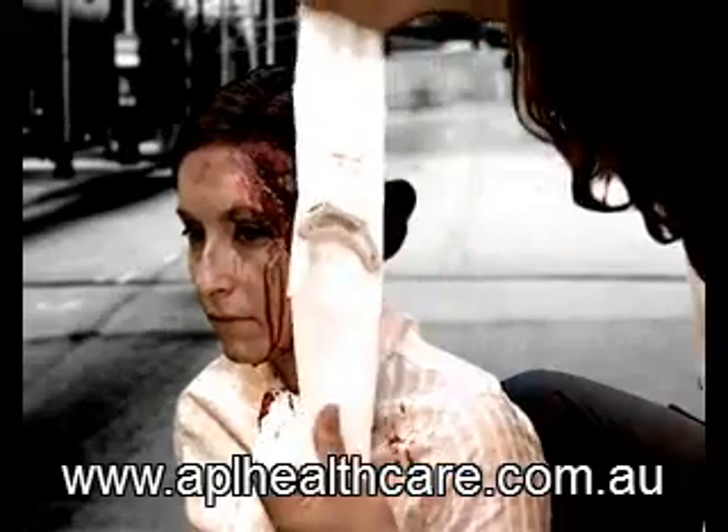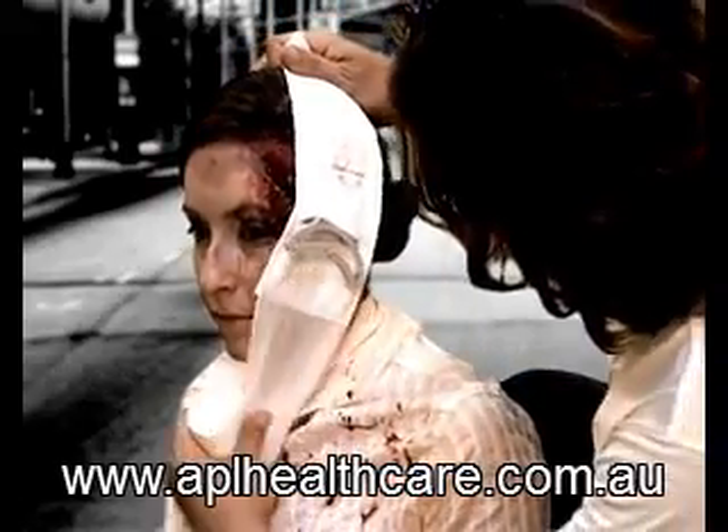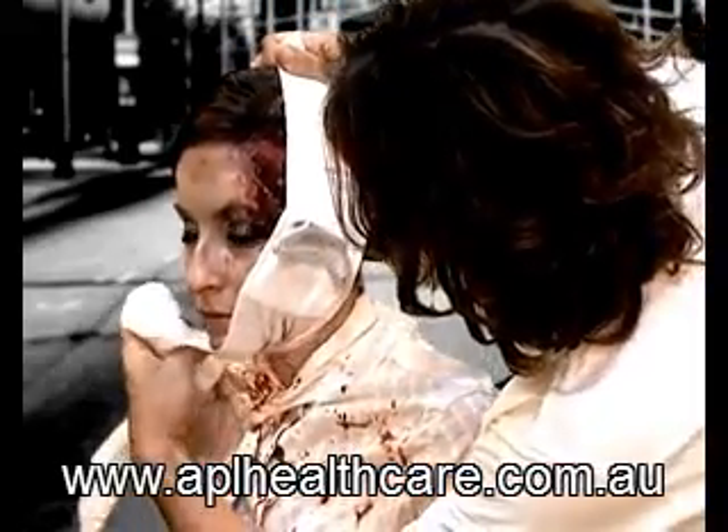Open the bandage and position the pad correctly. Wrap the leader around the head in the direction appropriate to the wound, always making sure to keep it firm and widely spread.